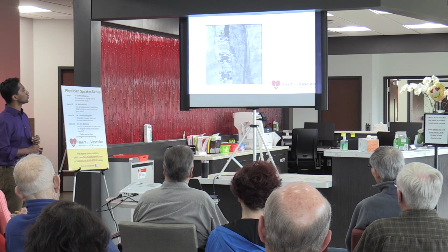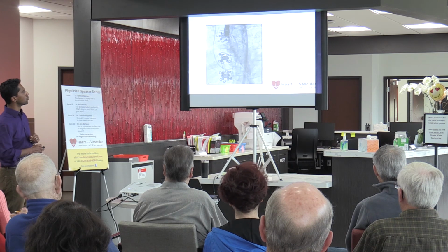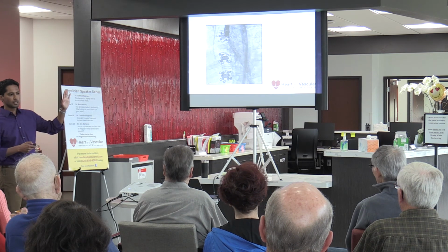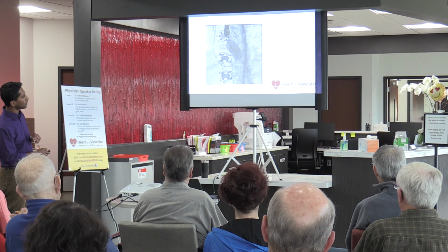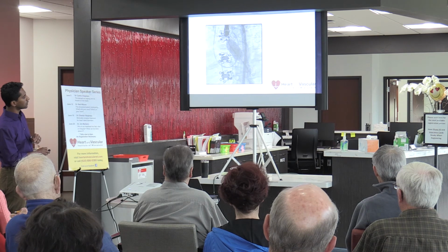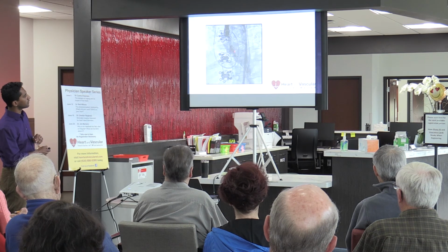So this is an actual case that we did. This is one of our first few cases. Just to orient you, this compared to the animation that we just saw: this is the catheter that's coming up from below. This is the wire that's passed up and out into the left lower chamber of the heart. And then this is the valve.